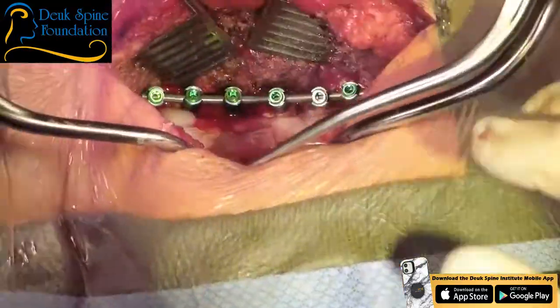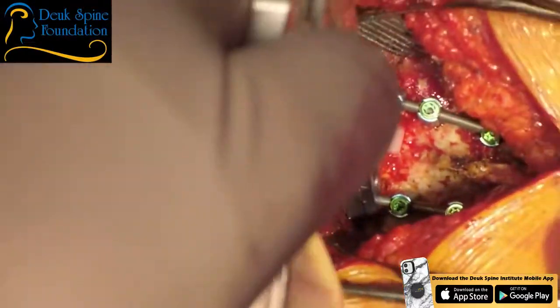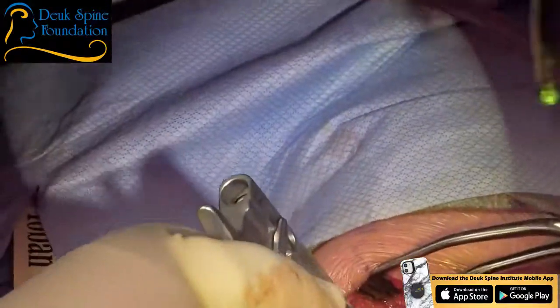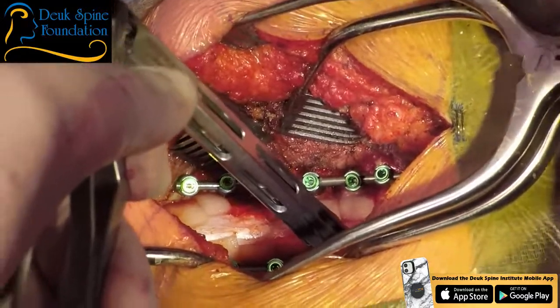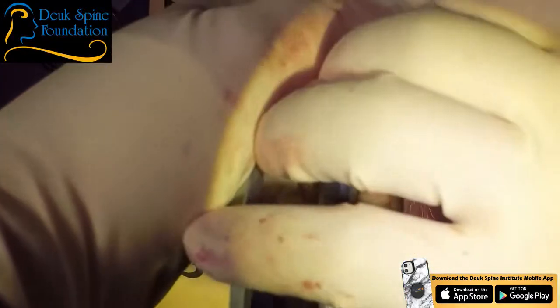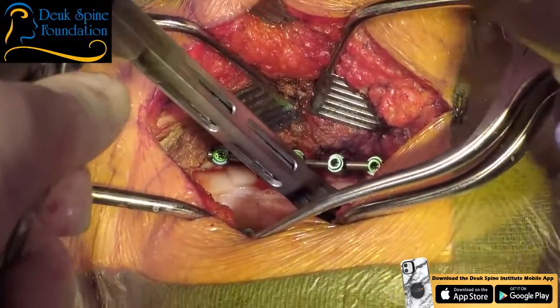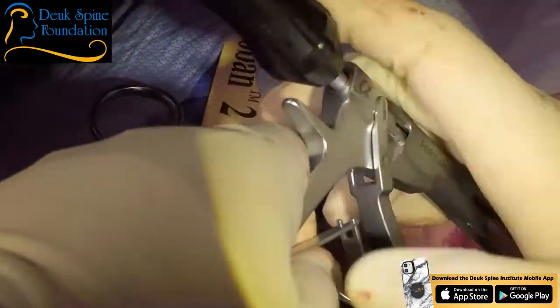Okay, so let's have a little irrigation next after I do this. I think this is my last screw. So this is C7-T1, and this is the one that, to me, looks a little rotated. So it's just not quite catching. I don't think I'm going to get it. Actually, I feel like I got it. Got lucky. Better be lucky than good, huh?